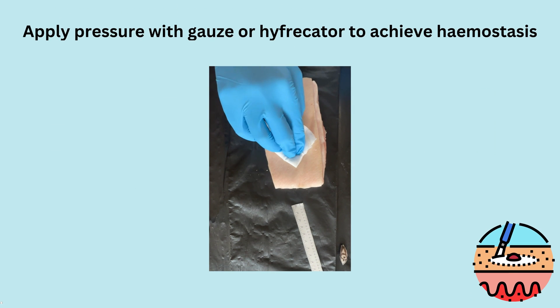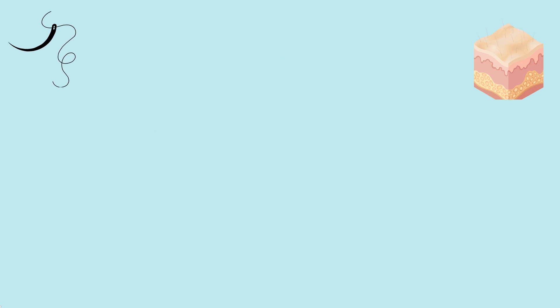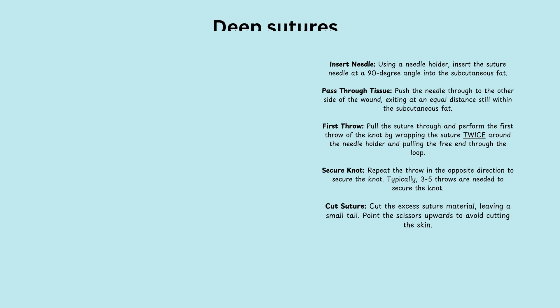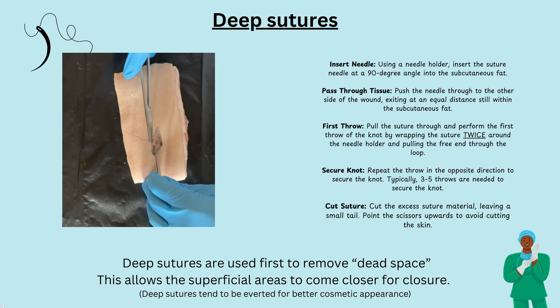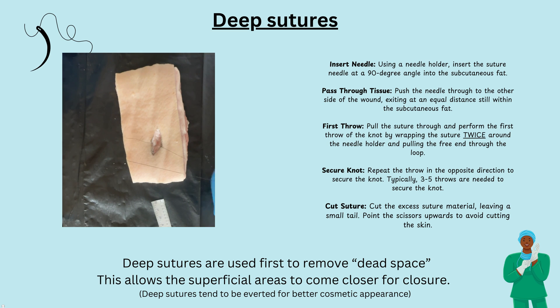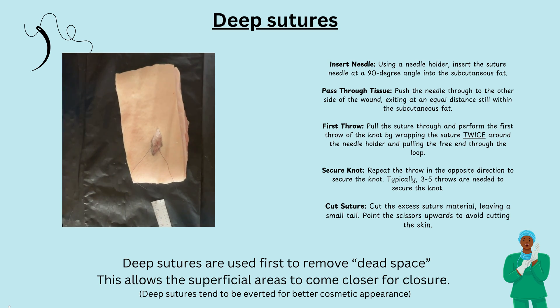In a real clinical setting, bleeding can be stopped by applying pressure using gauze. Now we're going to close the wound — this tends to require a two-layer closure. First, a series of interrupted deep sutures are used to remove what is called dead space. This allows the superficial areas to come closer together and improves wound healing. The deep sutures tend to be everted in angle for a better cosmetic appearance. Perform an instrument tie as you would have learned in medical school, but only through the subcutaneous fat.